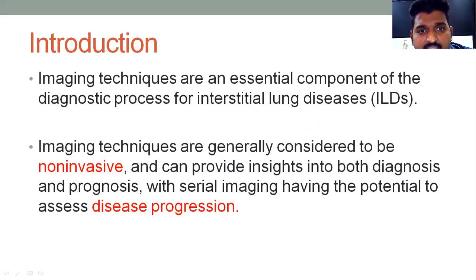As you know, imaging techniques are an essential component of the diagnostic process for any interstitial lung disease that we see in day-to-day practice. The imaging techniques are generally considered to be non-invasive and can provide insights into both diagnosis and prognosis of the patients, with serial imaging having the potential to assess disease progression.